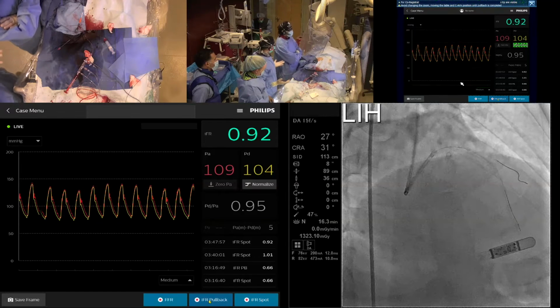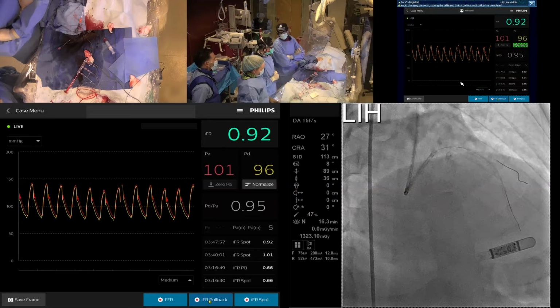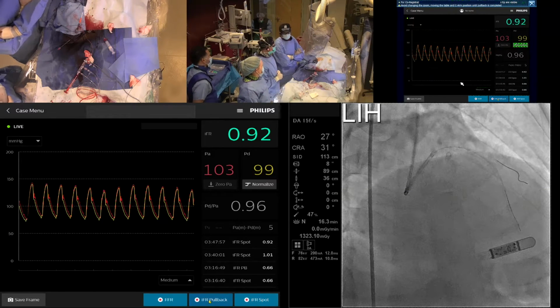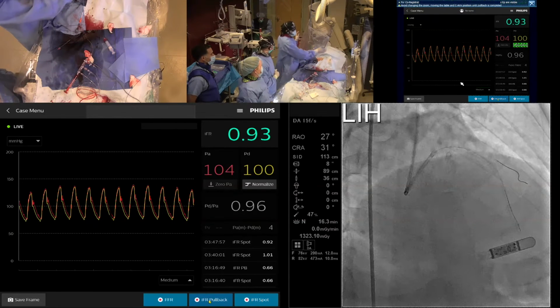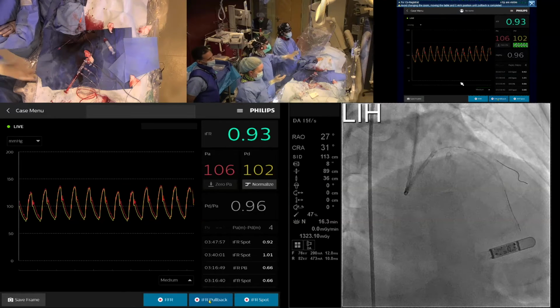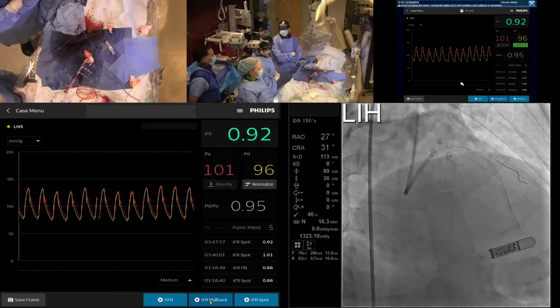Yeah. And the reason we don't do pressure wire, in honesty, is because it's so difficult to put the pressure wire down. I mean, if I wasn't, I would have just treated this. Yeah, I had planned to. I thought this was the culprit lesion. Yeah, it's amazing. And with this new wire, honestly, it's a game changer because now you can wire these. Even I can wire this. I mean, look, if you can wire this, there's no reason not to do a pressure wire for anybody at this point.